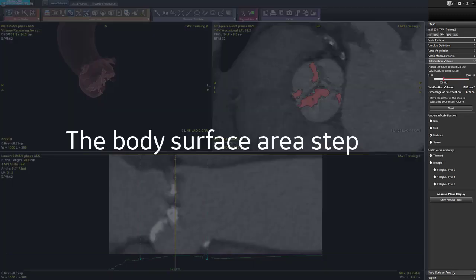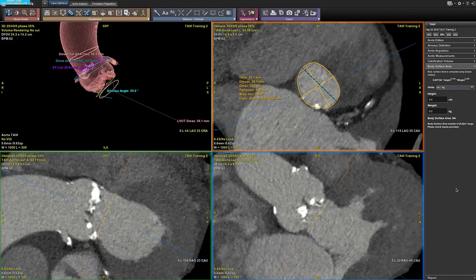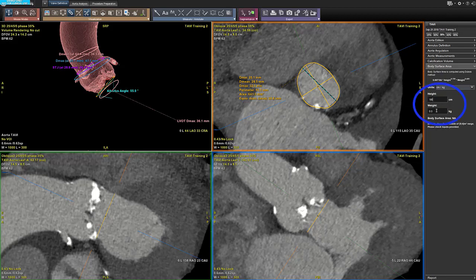We can now move on to the body surface area step. The height and weight are populated automatically. As we are showing an anonymous case, it is not already populated, so you enter the height and the weight of the patient to calculate the body surface area.